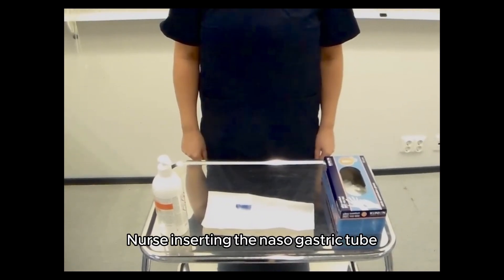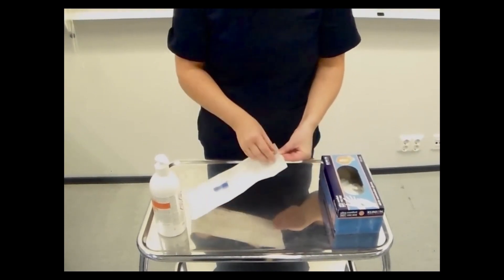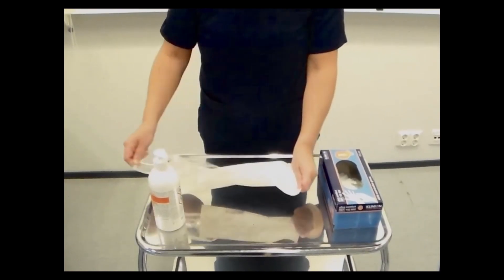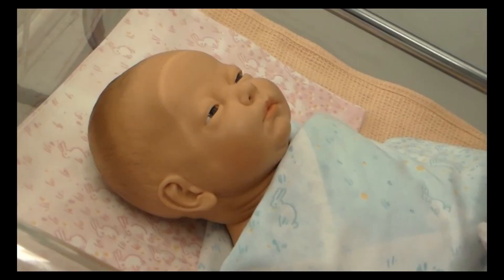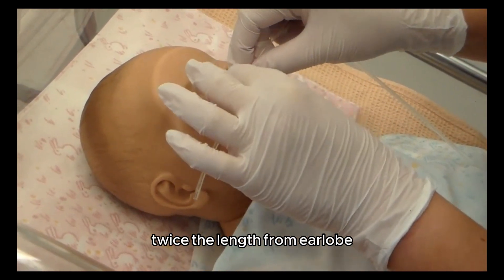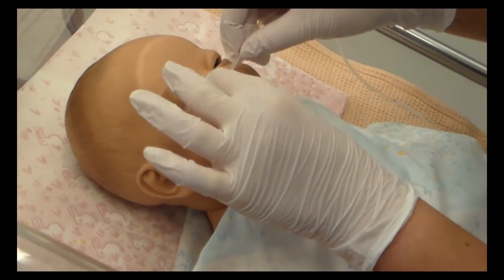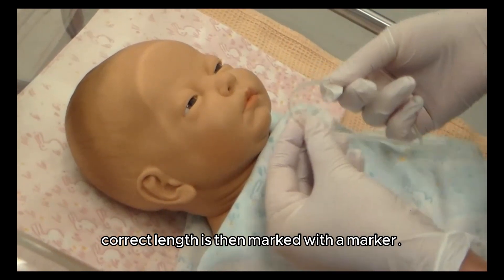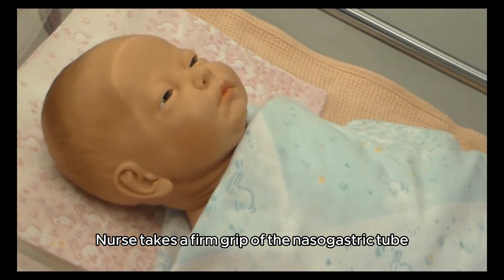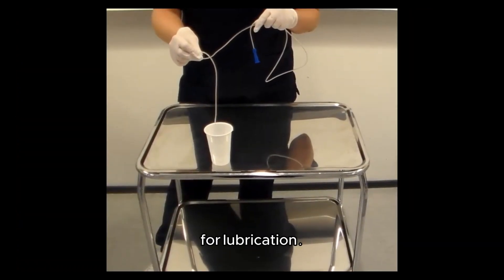The nurse inserting the nasogastric tube opens the package, disinfects hands, and puts on factory clean gloves. The correct length of the nasogastric tube is measured as twice the length from the earlobe to the tip of the nose, plus 4 centimeters. The correct length is then marked with a marker. The nurse takes a firm grip of the nasogastric tube and dips the other end into the water cup for lubrication.